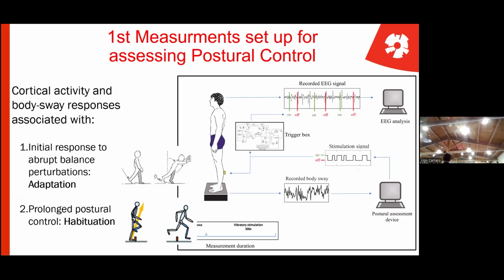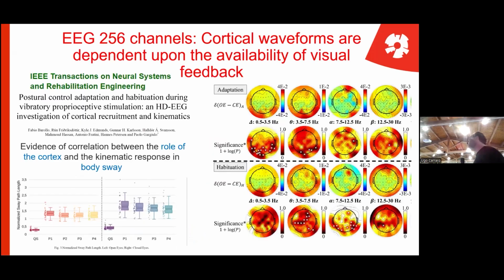So what is the immediate response to a postural control stimulus and what follows up as a predicted strategy to a stimulus that you expect to happen. So we wanted to study that first. And we added to the normal vestibular research tools the high-density EEG.